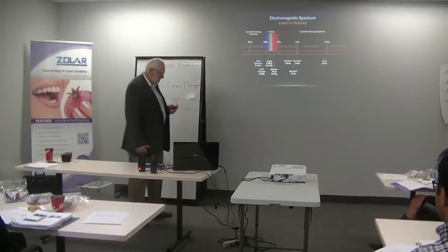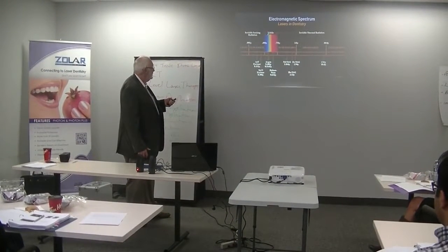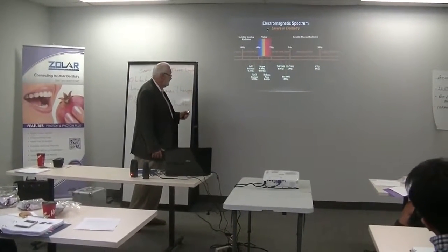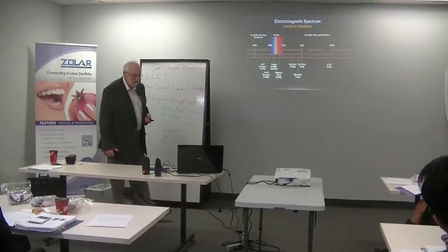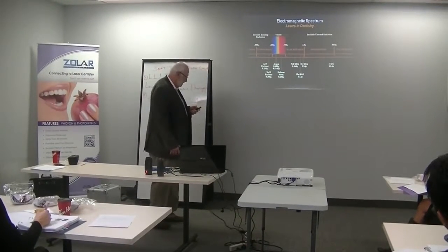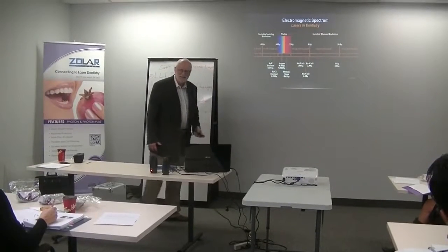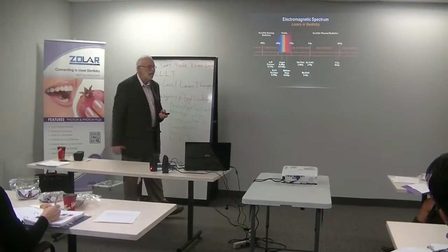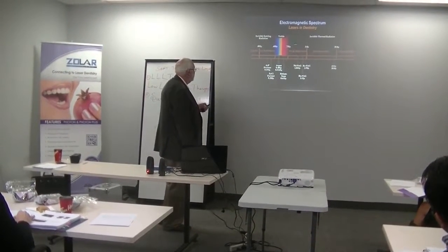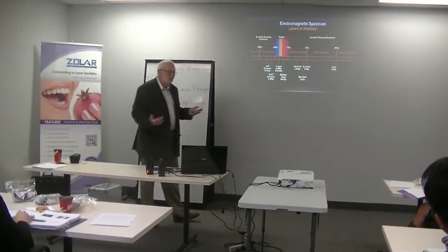Okay, remember I said the different colors? This is the spectrum of what we've got. This is our rainbow. That's all that is. So you can have lasers in all these different lights. Somebody is doing research in macular degeneration now, and they're using blue, green, yellow, and red to treat it. All different wavelengths having different effects, absorbed by different cells. And then you've got the near infrared, which is where that 810 is. So it's basically invisible to the eye.